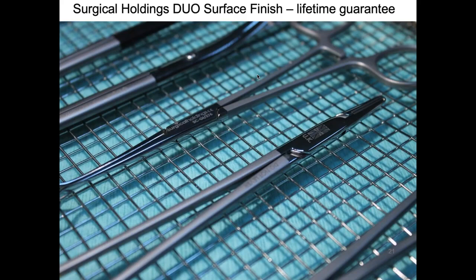Yeah, it's difficult because in Europe, a lot of the German instruments generally will have a matte finish, which can be a really high standard, really fine. And then in other areas of the world you might get a sateen finish, which isn't potentially as good. And in the UK we're used to a bright polish finish from the surgical devices and things like that. So there are a lot of different things to take on board, but that's certainly something to think about if you're experiencing different results in your wash: look at the different surface finishes.